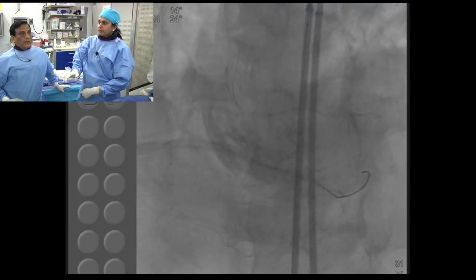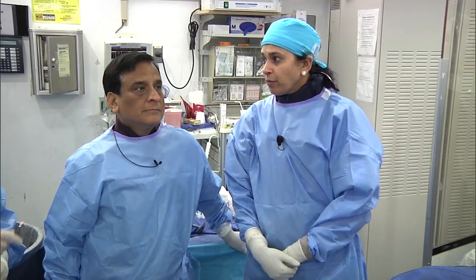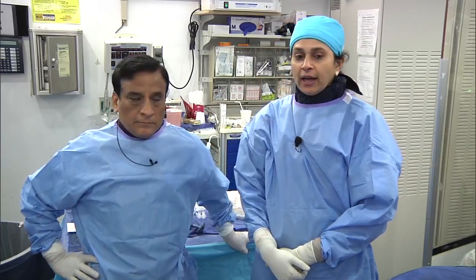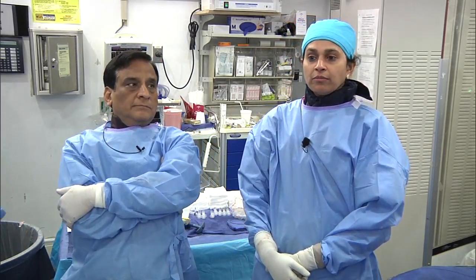Yeah. Samin, enormously instructive case. I would only add where Anu kept mentioning a faster modified technique, I think faster but preserves the safety. Exceptional case. Anu, you are checking the fluoro time for us. We have a dual injection dye of both, the bottle was how much? 140 dye and 37 20. Yeah, 37 fluoro time.